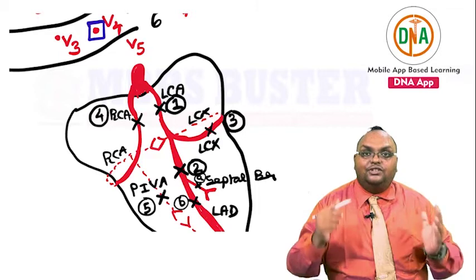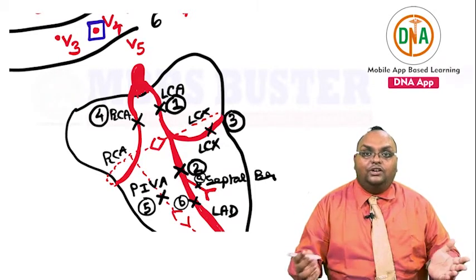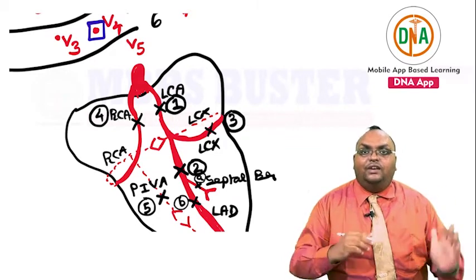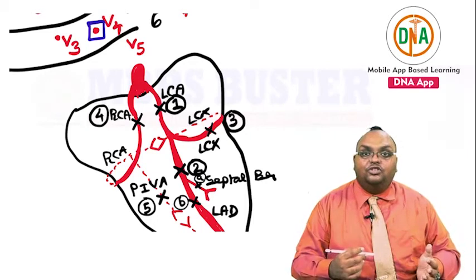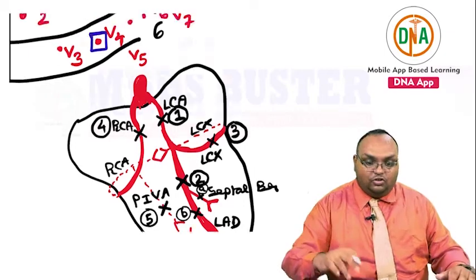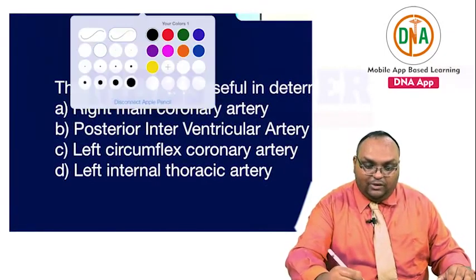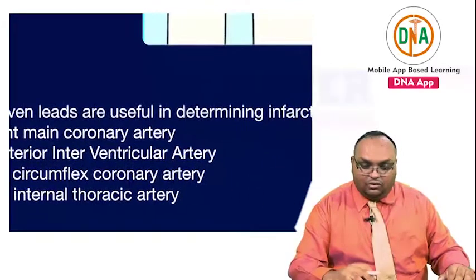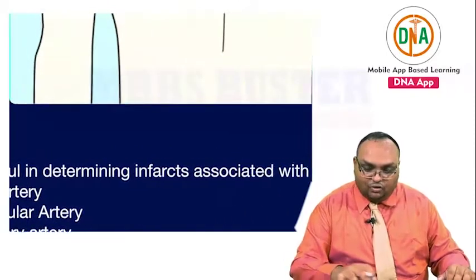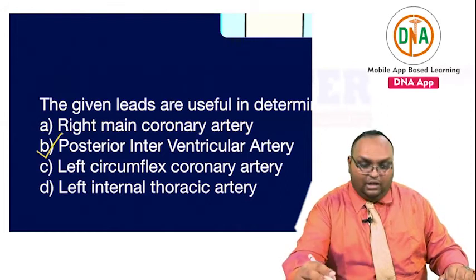If the right ventricle is affected, then V4R. And the posterior interventricular branch of the right coronary artery supplies the posterior wall, so that's marked as number 5: leads V7, V8, V9 show ST elevation, with concomitant ST depression on the anteriorly placed leads V1 to V4. So your answer over here is, I hope everybody can say with confidence right now, the given posteriorly placed leads are useful in determining infarcts associated with the posterior interventricular artery.